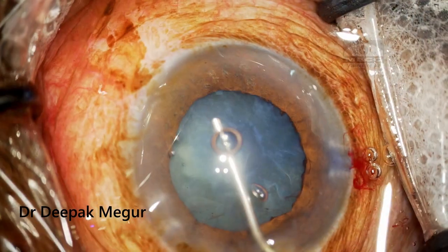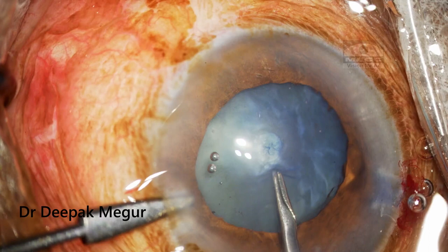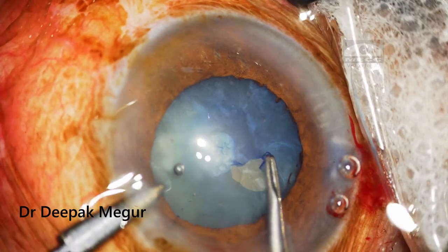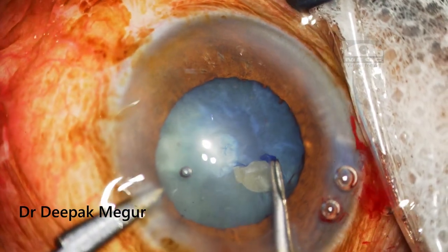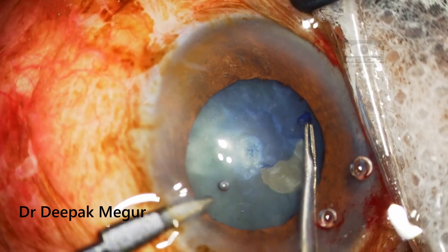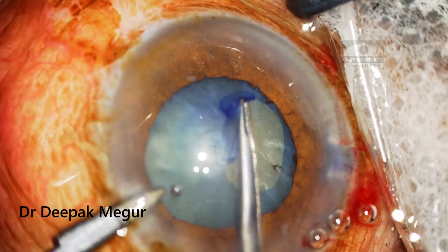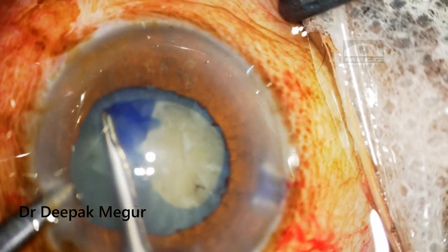Now I need to do the capsulorhexis. Because this was a hypermature cataract, we can see a central small zone of calcified plaque here, so I am consciously trying to avoid that area. I make an initial puncture in the paracentral region and then fold the capsule and perform the rhexis with the forceps.